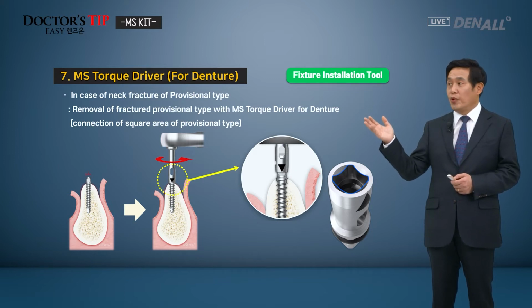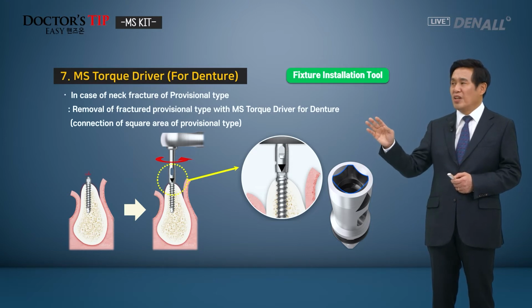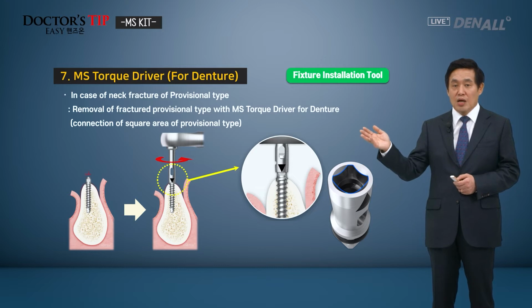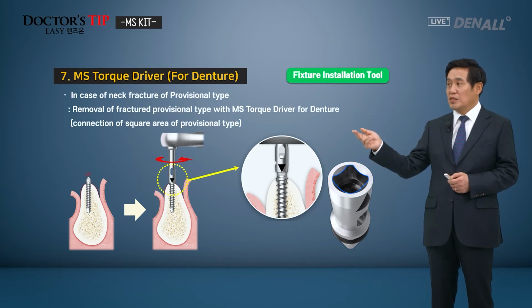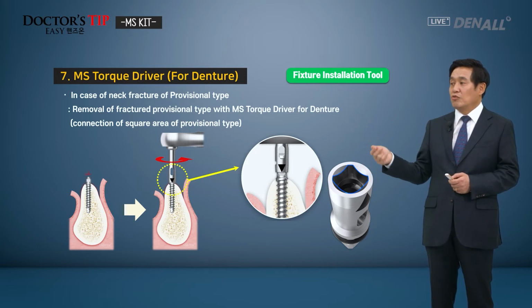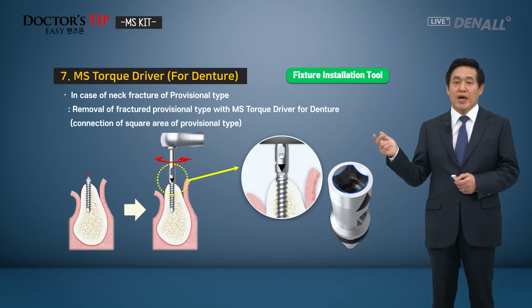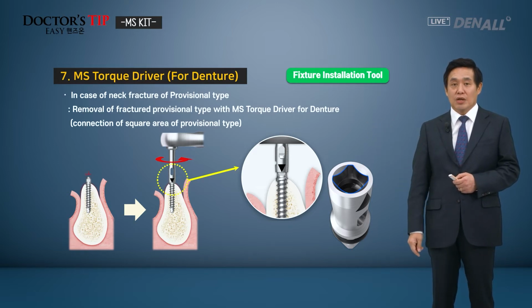And I will show you in the hands-on also, but for the provisional type MS implant, if you bend too much, or if you want to change the positioning of an already bent one, then the provisional type MS fixture sometimes fractures. And to remove that can be challenging. But fortunately, for the provisional implant, not the upper part, but below the neck, in the bending part, it's the same type as the denture. Therefore, with this denture type torque driver, the fractured provisional type MS implant can be removed very easily. Again, I'll show you this in the hands-on session.